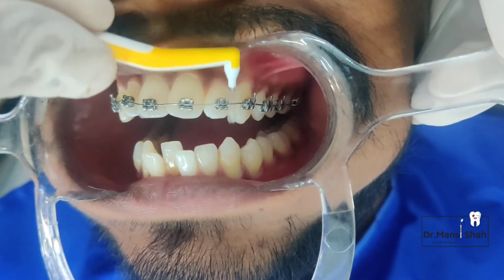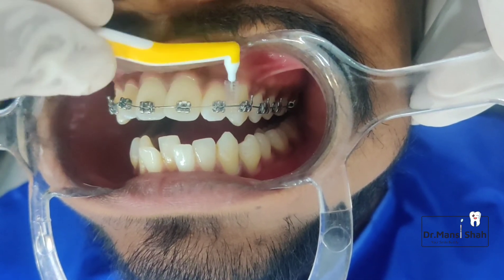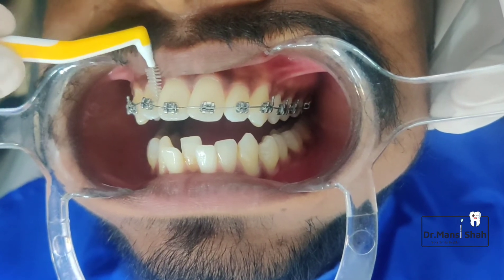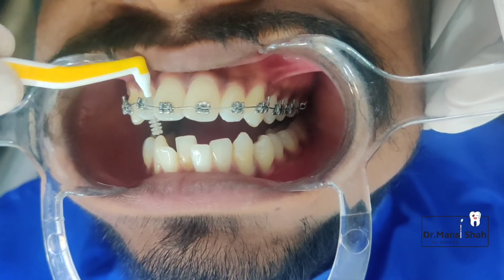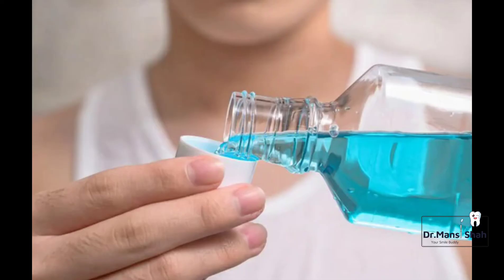Remember, do not push the brush into areas where it is not going easily, as you may break the wire or the brackets. It is recommended to use this brush after every meal. The next step is the use of mouthwash — a generous amount of mouthwash is very important to help you fight germs and bad breath.